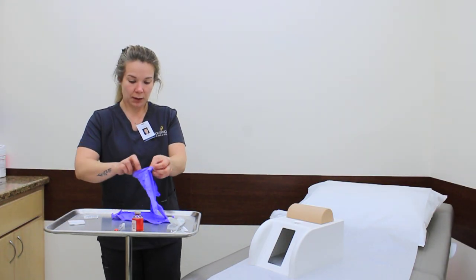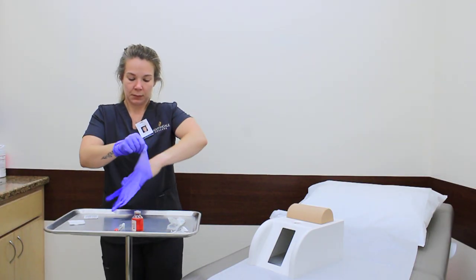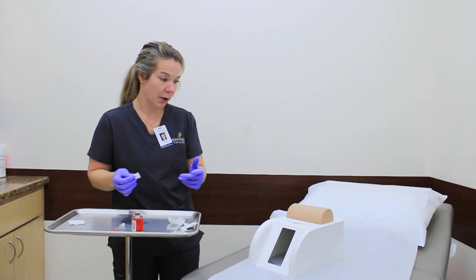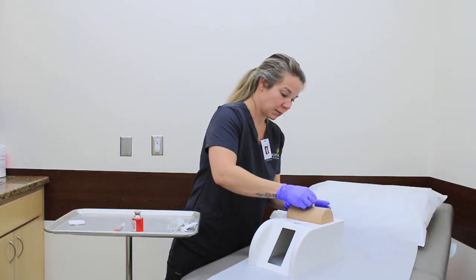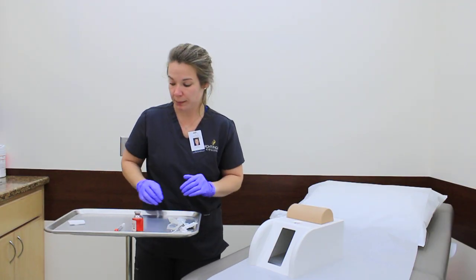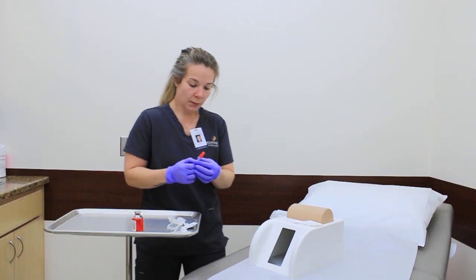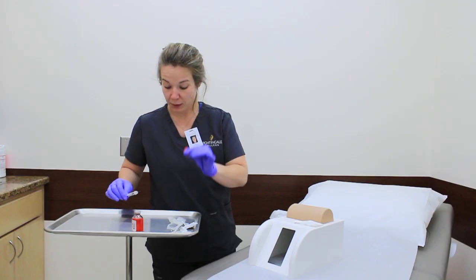So I will put on clean gloves since I did hand hygiene. And I'm going to prep the patient's skin. Since I have identified my marker, I'm going to start in the middle and go out about 2 inches, allowing the skin to dry completely before administration. I'm going to set some gauze here. And then, assuming the area is dried, we're going to remove the needle cap.